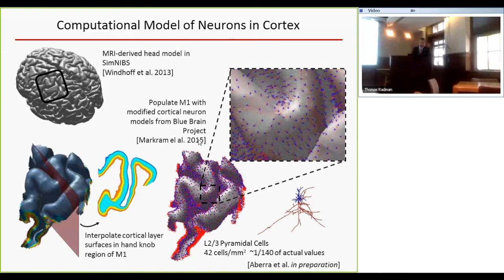which is good, right? And we had to do this myelination and a bunch of these kinds of adjustments that are appropriate, and that really affected the threshold. So we think that we have pretty good models, and now we can play with them. One way in which we like to play with them is to see how the results compare to experimental studies, right? If you have no relationship that makes sense with experimental studies, then obviously you're not modeling the right thing.